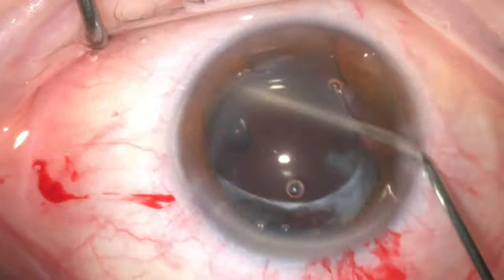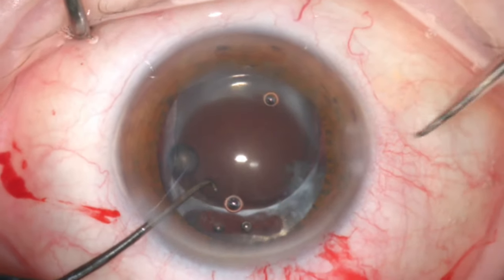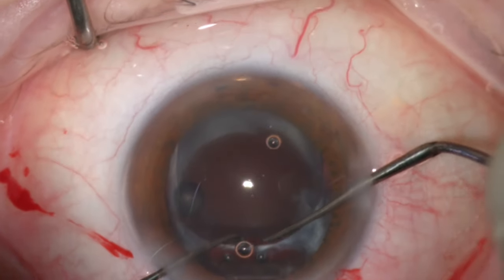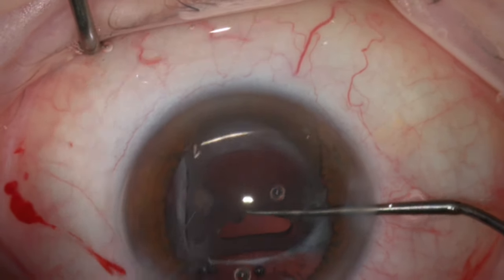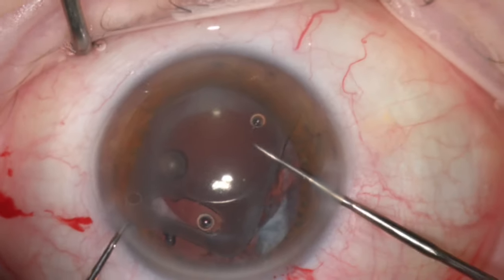Further visco-elastic was injected behind the lens to protect the posterior capsule and to vault the lens outside the bag. Then the other haptic was explanted in the same way using two instruments — one supporting the bag and the other to explant the haptic. The lens is now free in the anterior chamber.